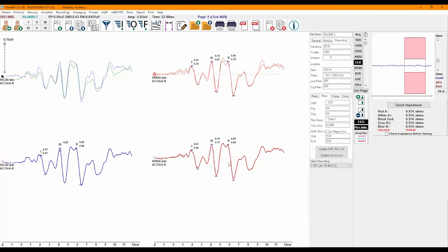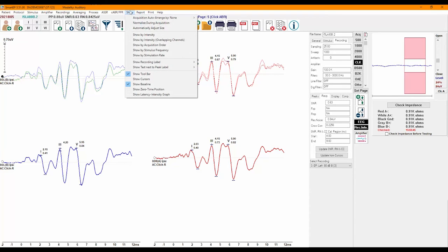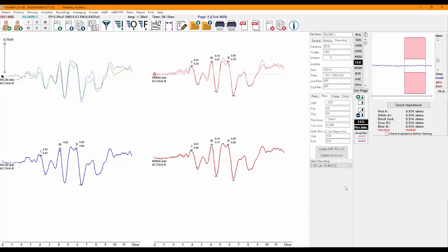When testing infants, it is not uncommon to test one ear first through all frequencies, then proceed to the other ear. Using this feature, you can easily move the right ear recordings to their corresponding pages, then switch to the left ear and send those recordings to the pages. You will then have recordings arranged with the right ear recordings on one side and the left ear recordings on the other side. This makes preparing and generating your report a smooth process.